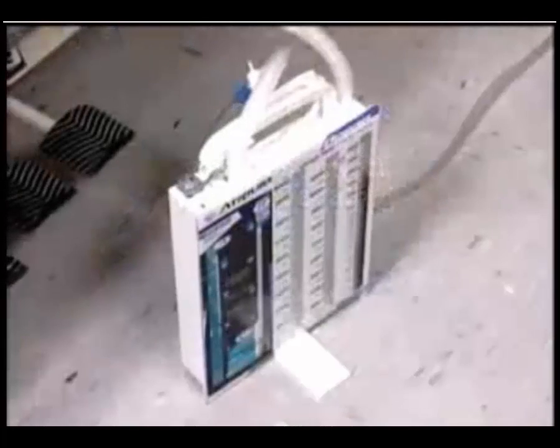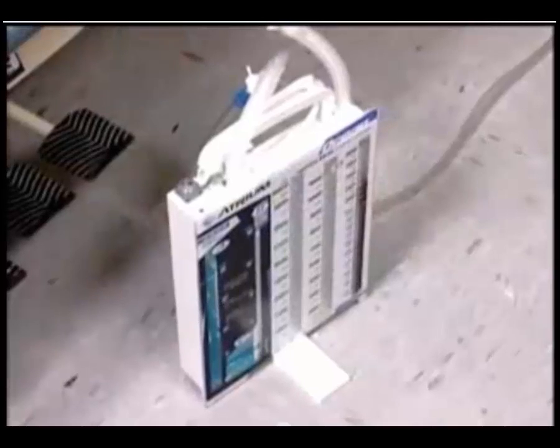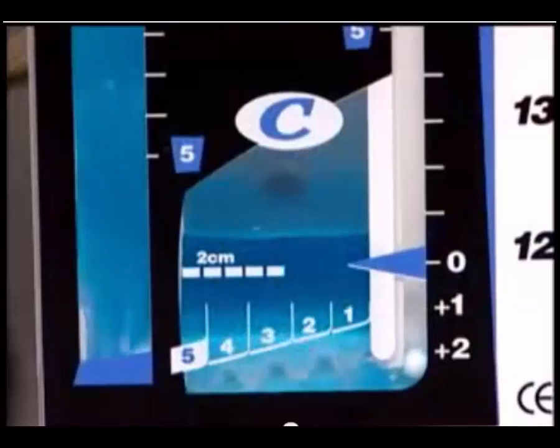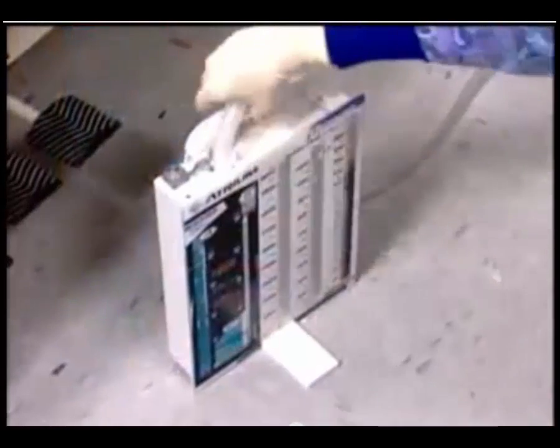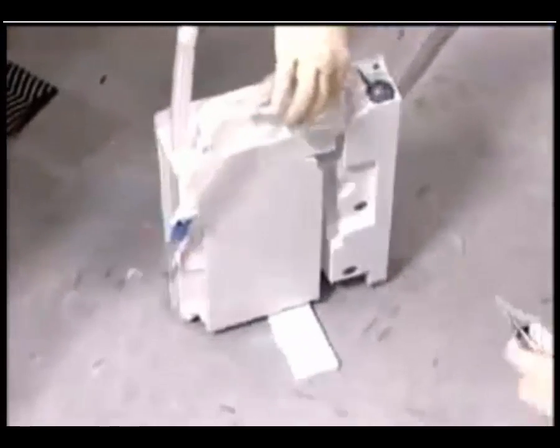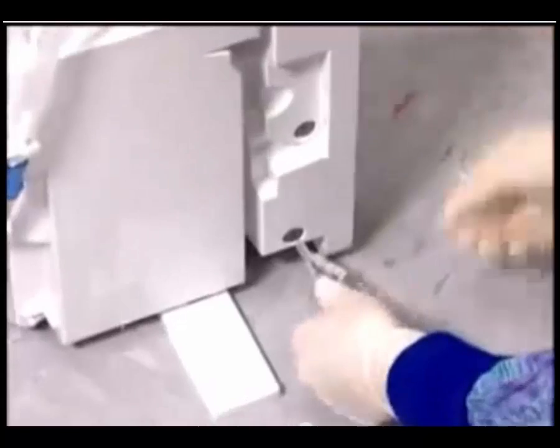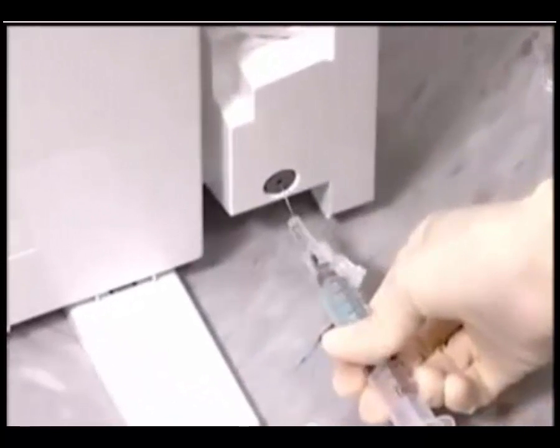When monitoring a patient's chest drainage system, it's important to periodically check the water seal's operation and fluid level. If the water seal is either underfilled or overfilled, it should be adjusted accordingly to the prescribed maximum 2 cm level. Using a 20-gauge needle with syringe, adjust the water level via the grommet located on the back of the water seal chamber.